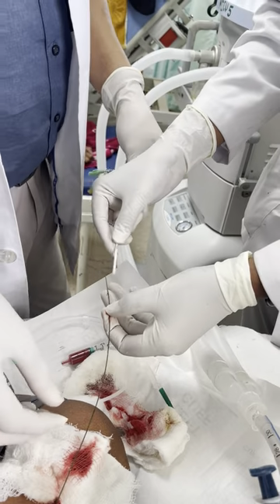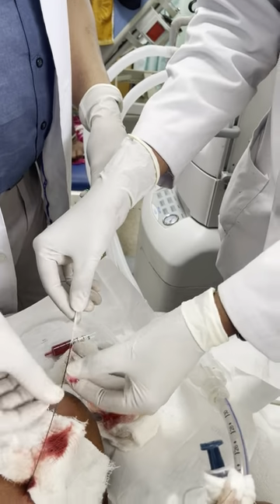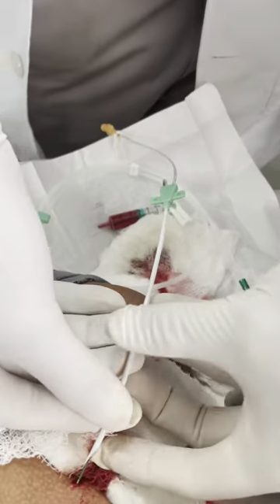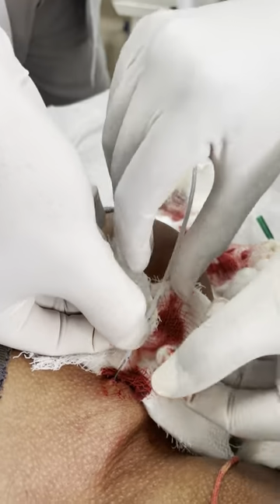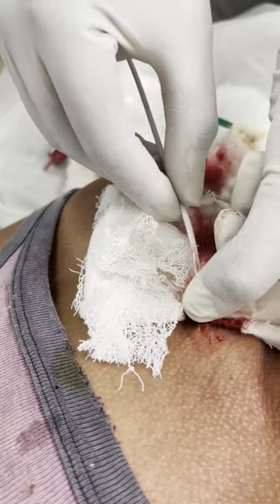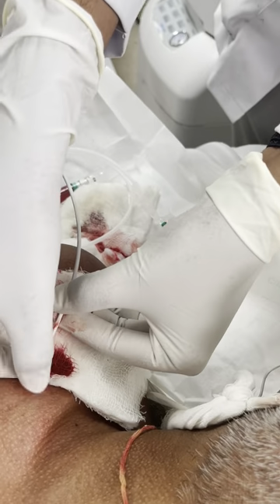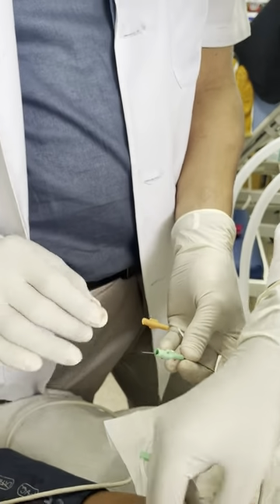The time has come for the final moments. Very good, very good. Now, hold, no, don't do like this. Now hold everything here. What you will do? You will hold the line, you will push it back. Do this. Push it back, very good. It will come out from the green channel. See, girl, what's your name? Anushka. See, this is coming out. You can see it is sliding out, moving out. So hold it. Our job is done.